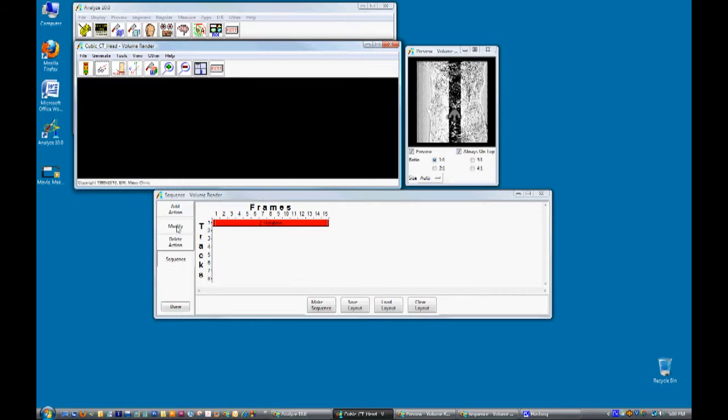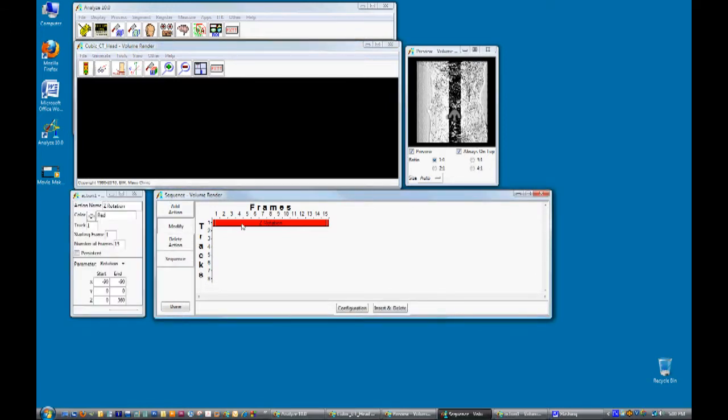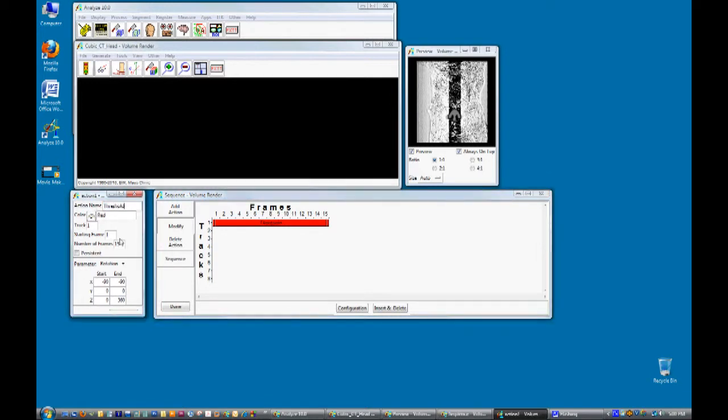Click on the modify button and then click on the Z rotation action. Change the name to threshold and set the number of frames from 15 to 32.